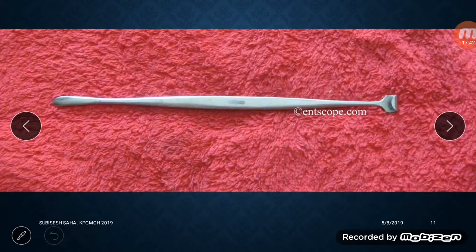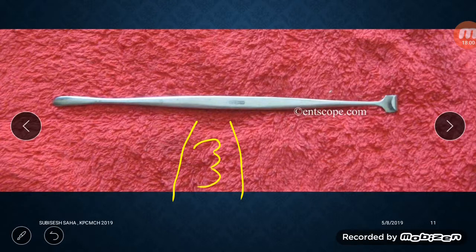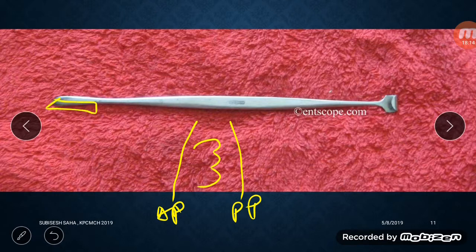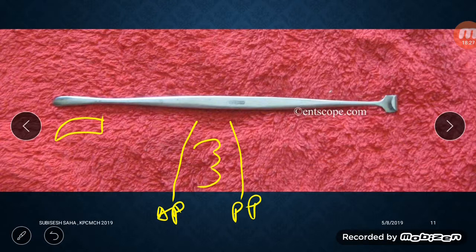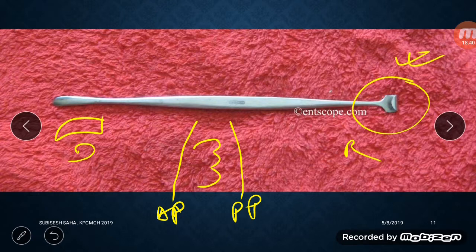The next instrument is the tonsil dissector and anterior pillar retractor. The tonsillar fossa is a fossa between the anterior and posterior pillars where the tonsil is present. This instrument has a blunt dissector-type end and a retractor end used to retract the anterior pillar, allowing us to see if any tonsillar tissue remains after surgery. The dissector end is used to dissect the tonsil from the tonsillar fossa.